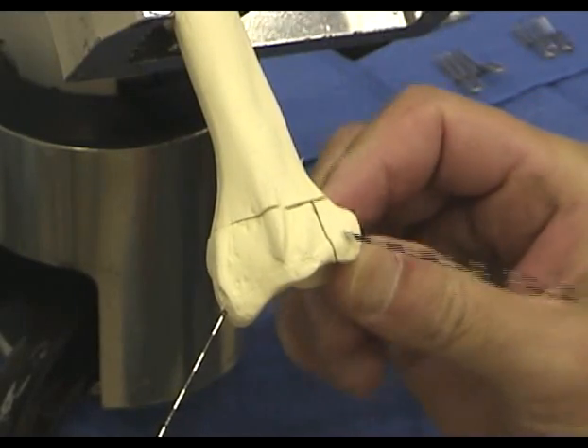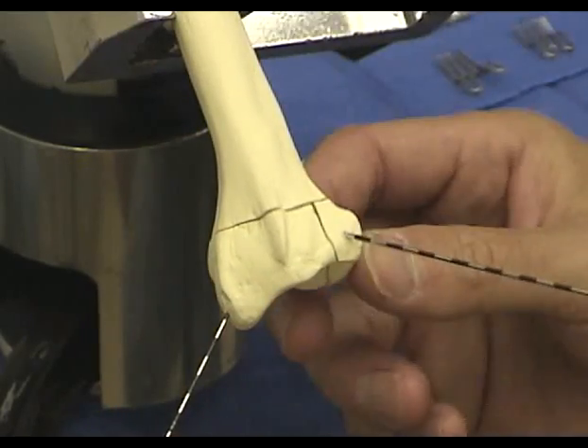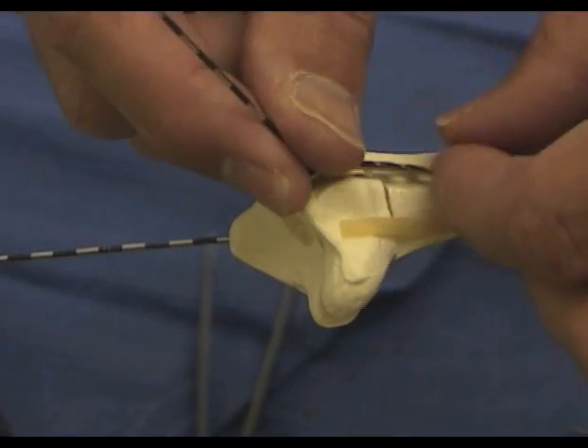The typical amount of stability this simple pinning provides can be noted. Proximally, the ulnar pin plate should be aligned with the ulnar border of the radial shaft.